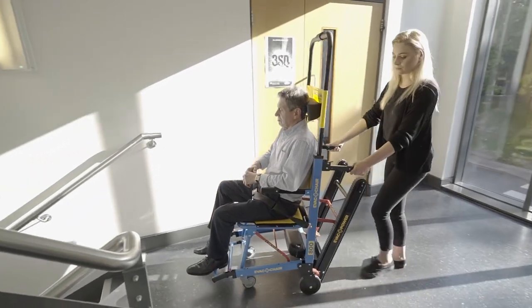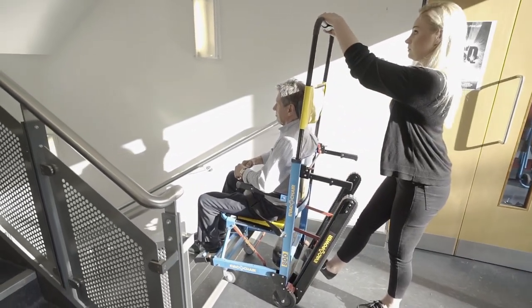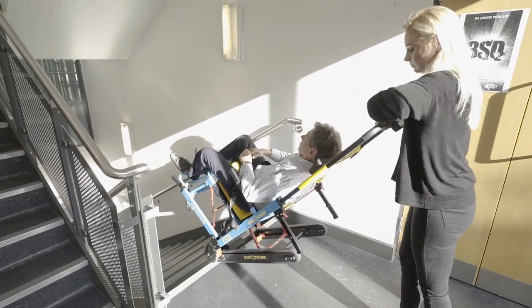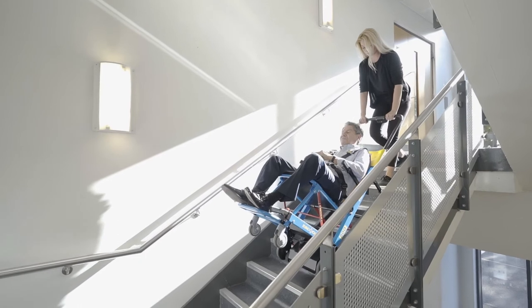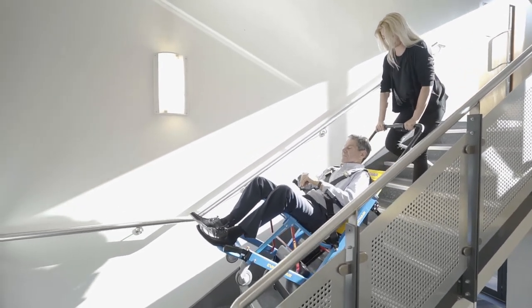For stairway descent, make sure the handle is locked in the desired locking position. Then roll the chair to the stair edge. Tilt the chair back to its balance point for tracks to meet the floor and press the down arrow on the control panel. Keep the downward arrow depressed while keeping the chair straight. Allow tracks to meet their glide angle.